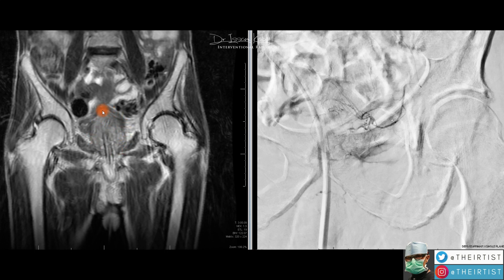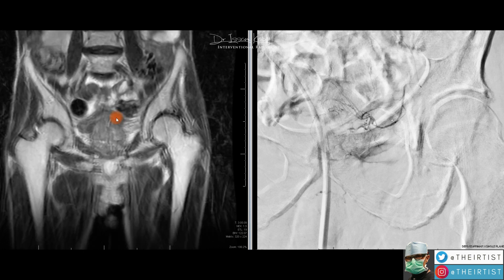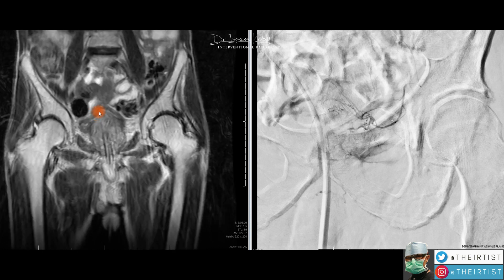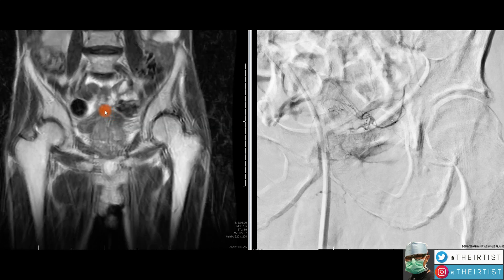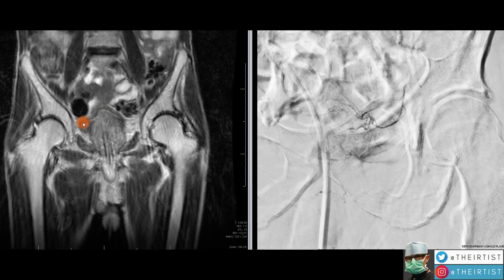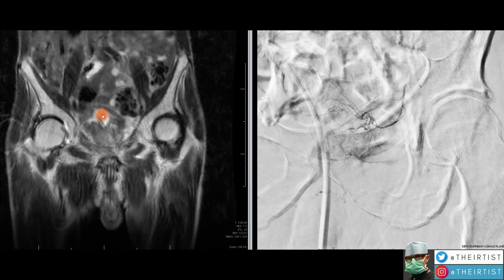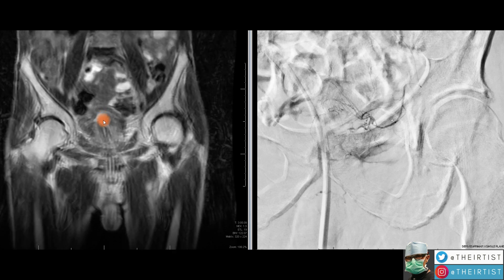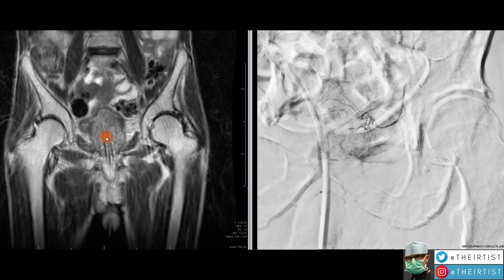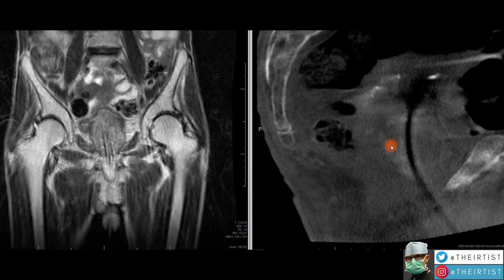The prostate is pushing the base of the bladder, due to hypertrophy of the median lobe, which causes urination issues in men. Above it we can see the totally decompressed bladder — there's no urine at all. We see the retention balloon of the Foley and the catheter in the middle.